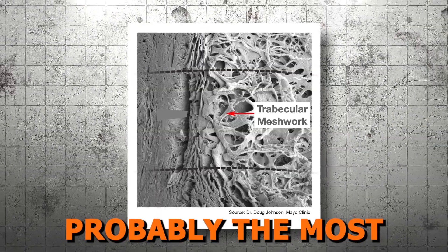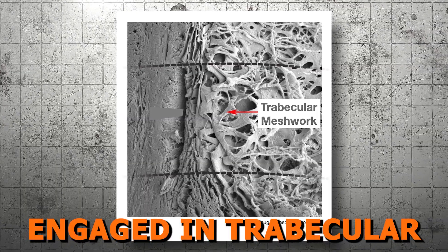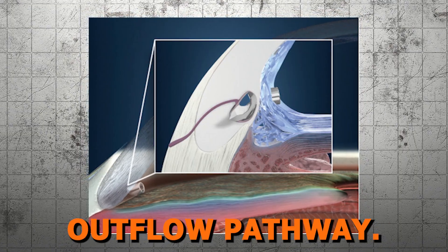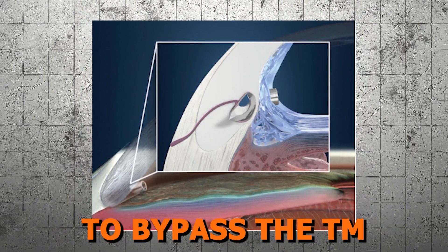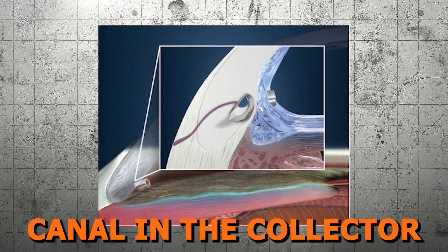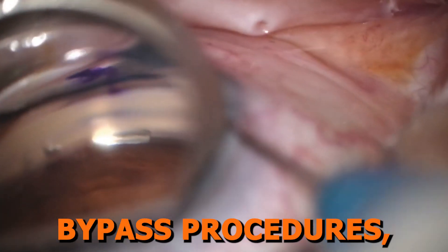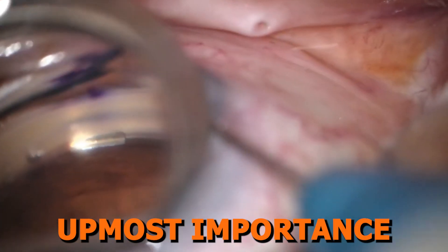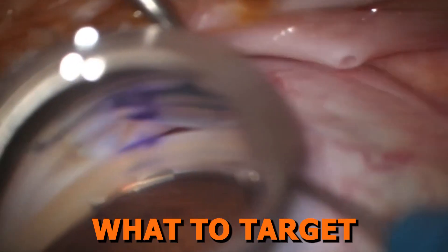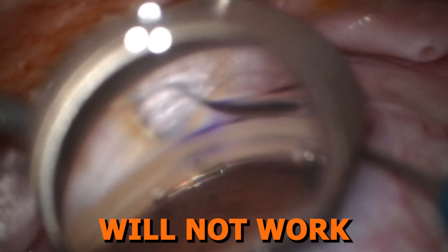The TM is probably the most important structure to be able to identify because this is the target structure engaged in trabecular bypass stenting. As a primary site of resistance in the trabecular outflow pathway, using a stent to bypass the TM area and divert aqueous humor past the clogged TM directly to Schlemm's canal and the collector channels is a very beneficial MIGS treatment option. While performing TM bypass procedures, it is of utmost importance to know and understand this angle anatomy to correctly perform the procedure, knowing what to target and what to avoid. If not properly positioned, the devices will not work effectively.